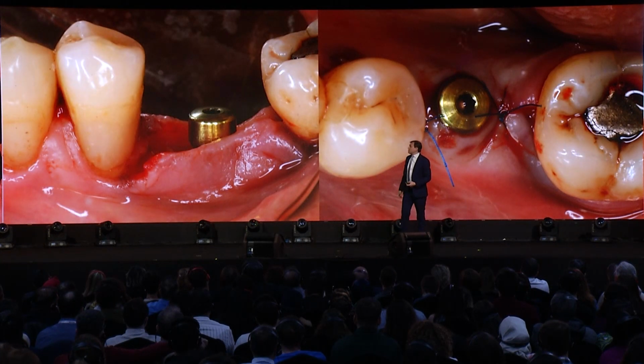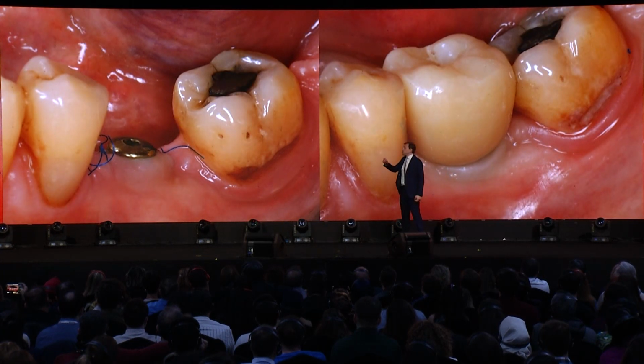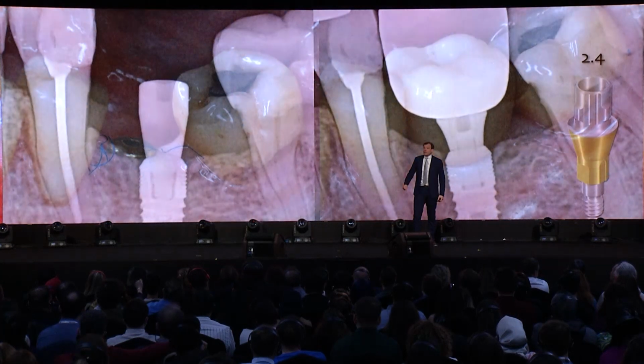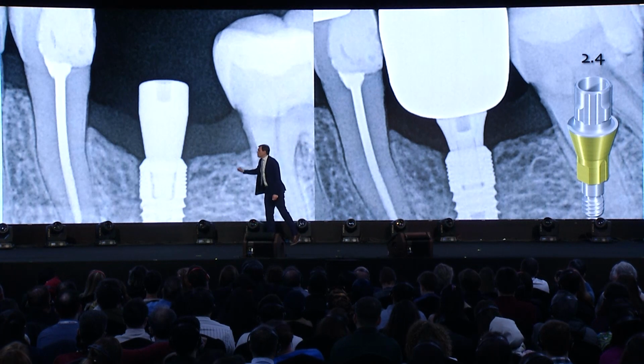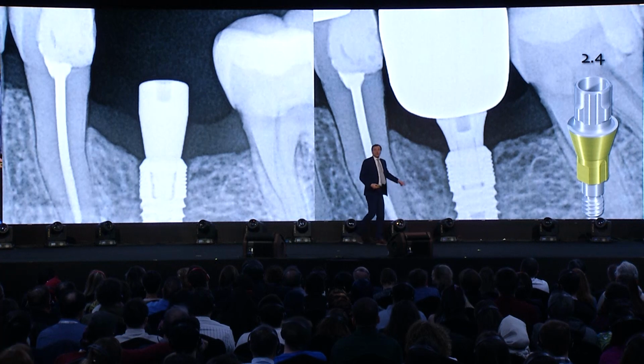Then healing abutments and one-stage surgery. And then just full zirconia contour restorations. And then I just followed the X-rays after healing, at 1 year follow-up.